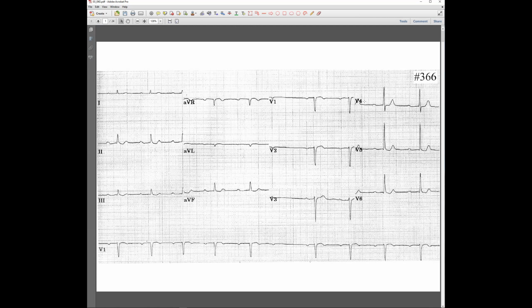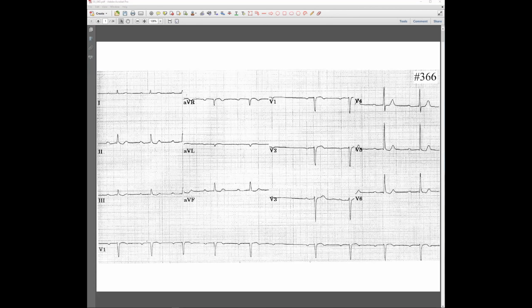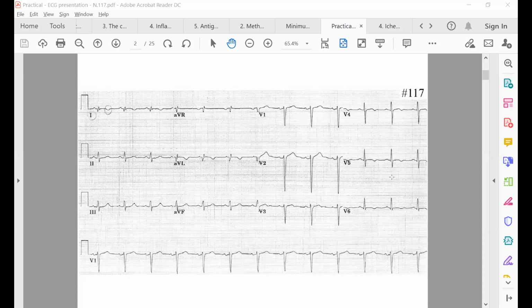All right. Now, the next one is Istvan. Yes, hello. Can you share your screen? Sure. Share it, please, because now you can demonstrate much easier if you use that one. All right, can everybody see? Yes, terrifically. Okay, lovely. So I'll start from the beginning. Can you see my cursor?